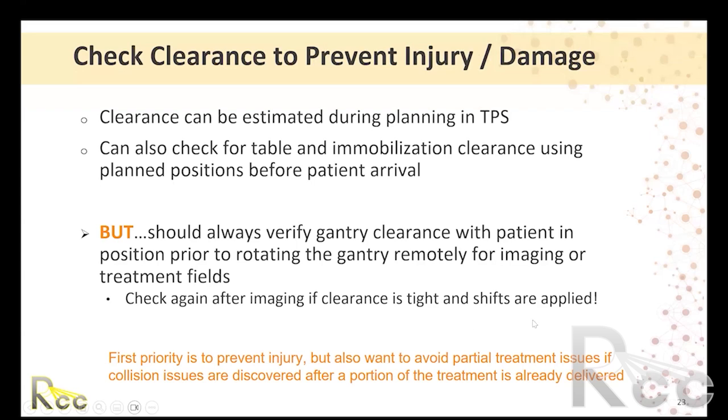Julie, I think this is a very, very important aspect because I remember very much in 2016 at our center, by then we had one functional machine, and I remember it was a Cobalt 60 machine. Due to not checking for the clearance before turning the gantry, there was some sort of stool on which you could step before you get to the couch.